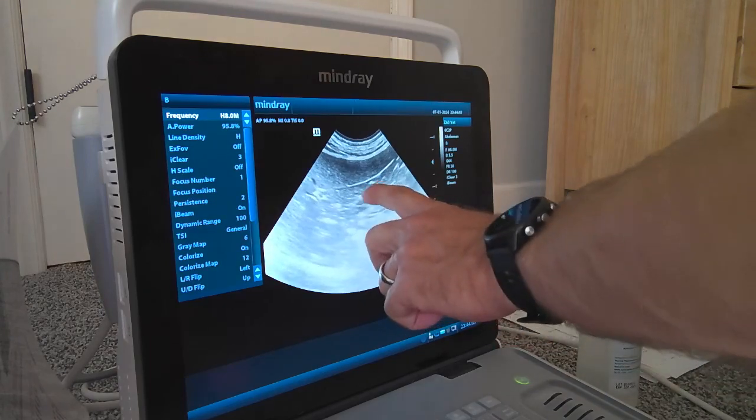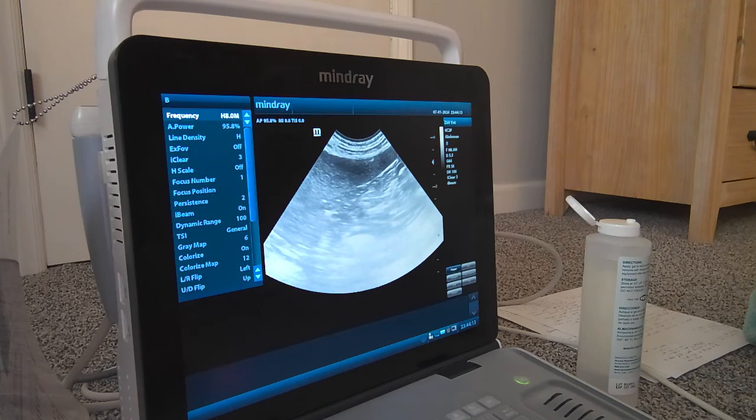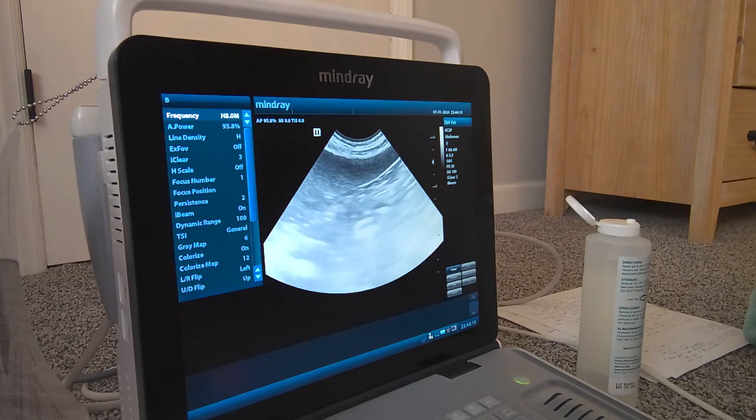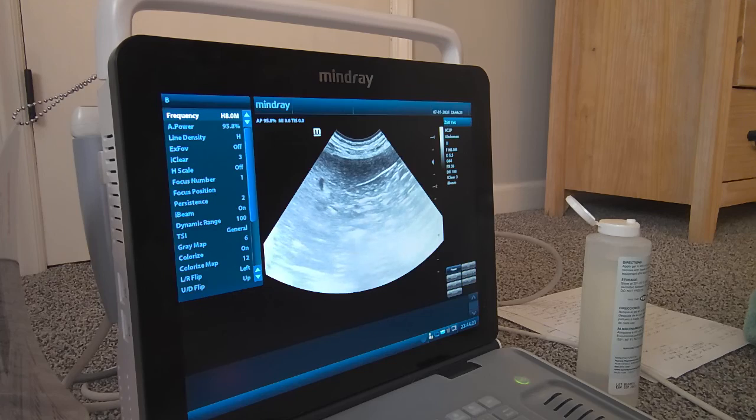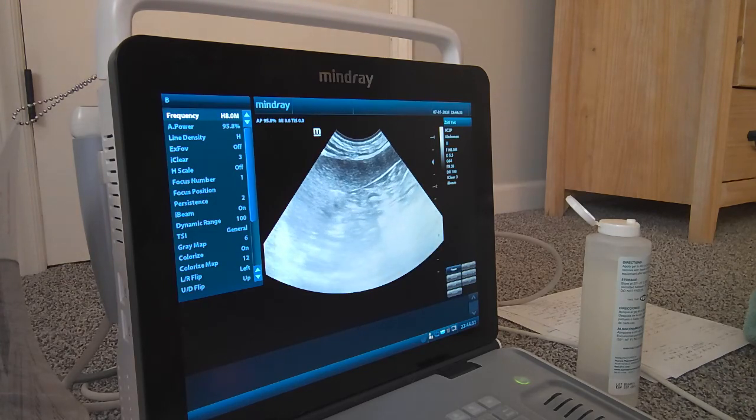Actually starting to get some pancreas, that left limb of the pancreas, into view here. But again, that's hard to see as a beginner, so we won't dive into that too much. What else did I want to mention about these guys? Splenic torsions. Splenic torsions I mentioned before. Anechoic areas. Sometimes there are even multiple parallel echogenic lines. I've heard the term lacy appearance thrown out there for them as well.